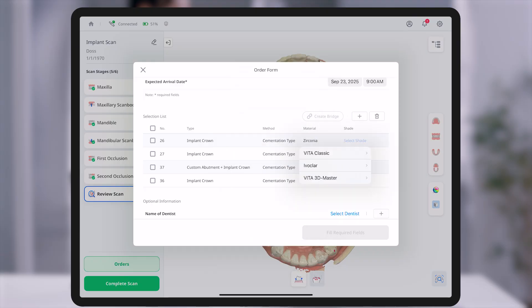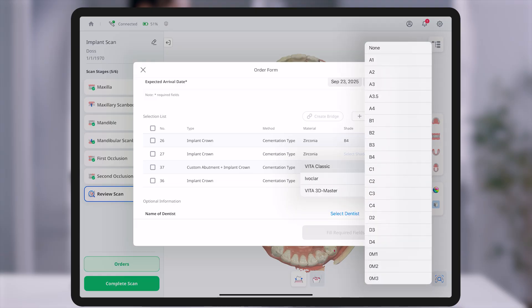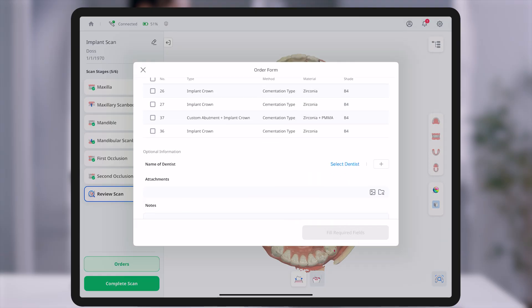This information serves as the foundation for dental laboratories to create precise restorations, so accuracy and completeness are essential.